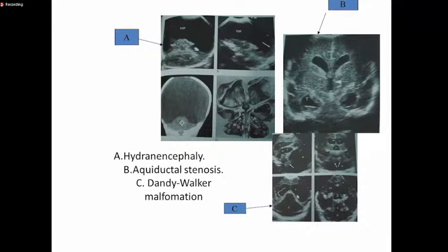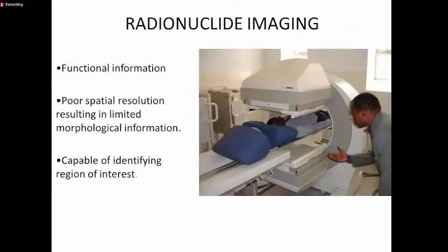So it's possible with the imaging. Now this machine is in Kenyatta. If you want to see it, you can see it in the nuclear medicine department. And what happens here is that you inject the patient with a radionuclide. Radionuclide is anything that emits some radioactivity. Usually we use gamma rays, and we are able to monitor that with this.